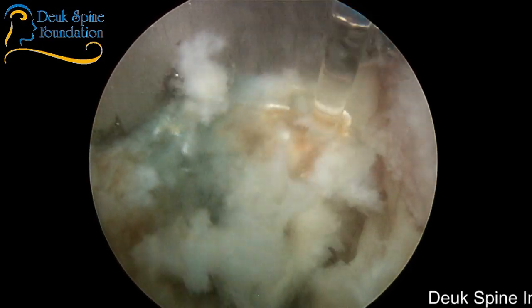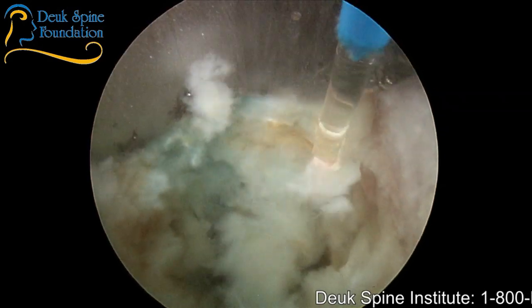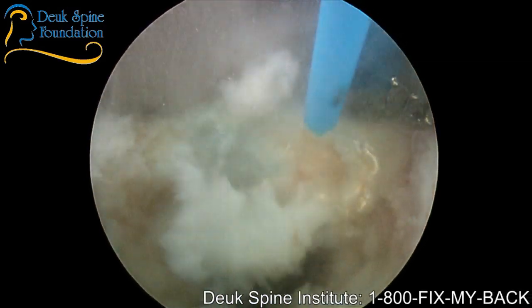All right, you can see the end plate at 3 o'clock. It's really scarred up. This is a really scarred up herniation I'm just working on laterally. And I will take the question.